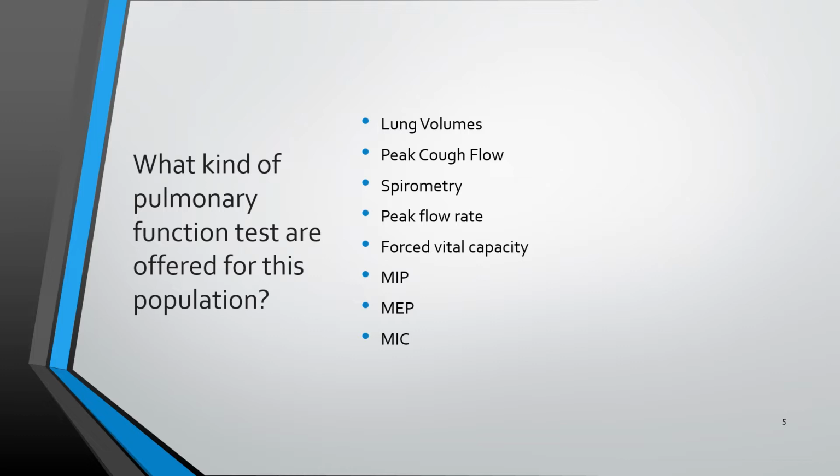Another very important feature of bedside spirometry is peak cough flow. Peak cough flow is very important in relation to coughing. Why is coughing important? Coughing is important because you need to mobilize secretions in your lungs that could be potential pathogens. The typical cough consists of the following sequential steps.